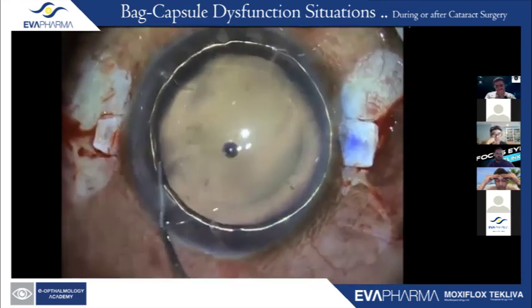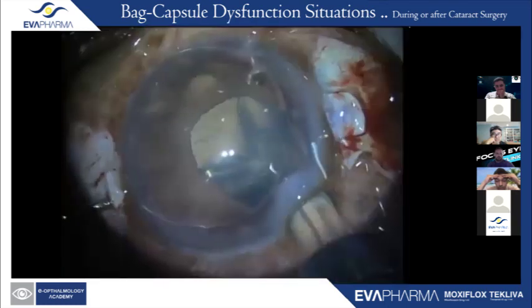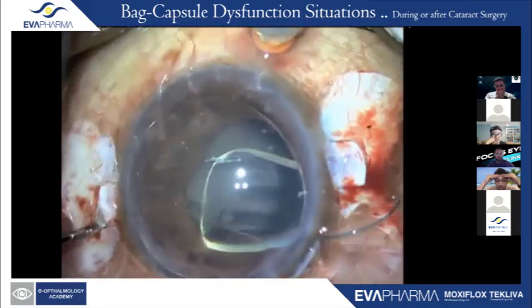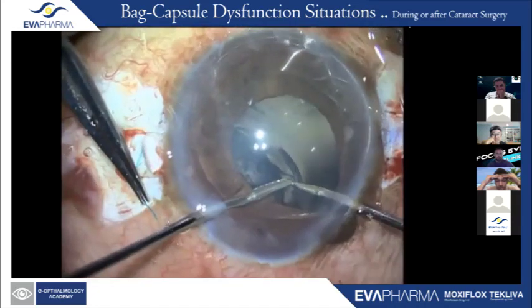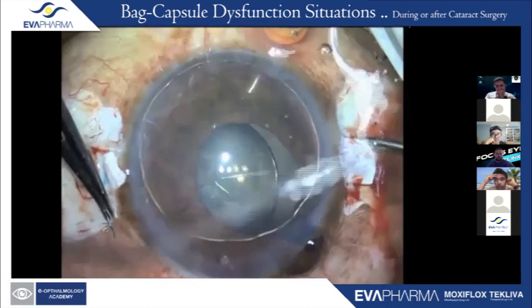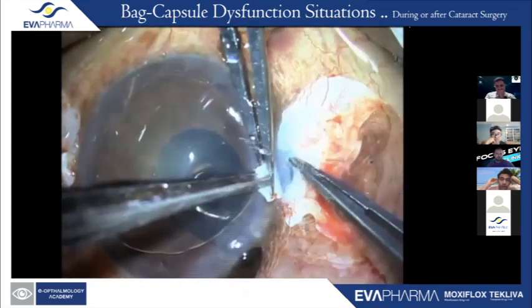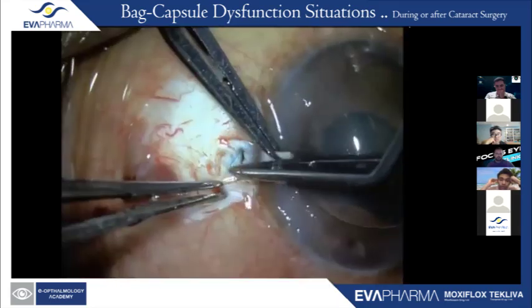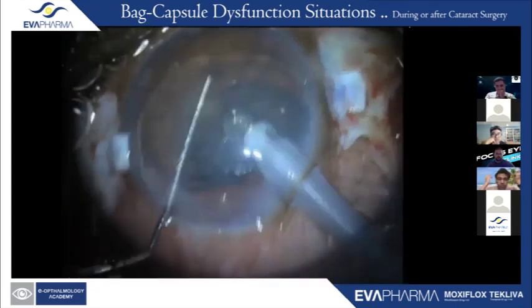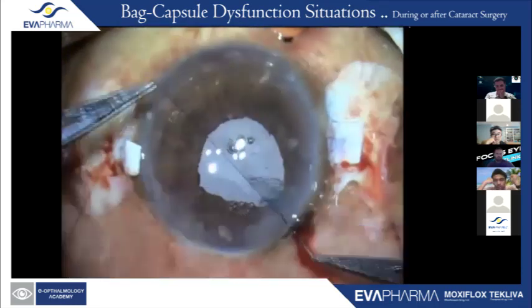bringing the nucleus up into the anterior chamber. Using the limbal ports and the sclerotomies that I have made, I am doing an anterior vitrectomy. Once I'm done with that, I'm externalizing the haptics under this transparent nucleus. The fortunate fact over here is the nucleus has to be a little bit transparent. Once you're done with this, you can tuck those haptics inside, and your pupil is small because I put pilocarpine already inside, and you really can just emulsify this.